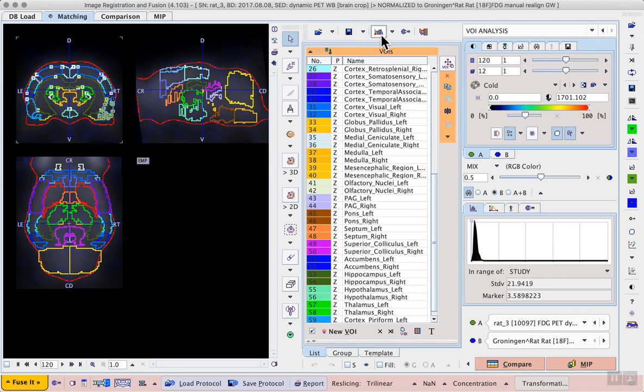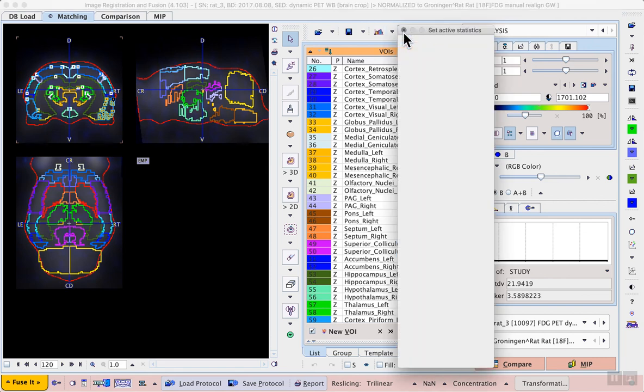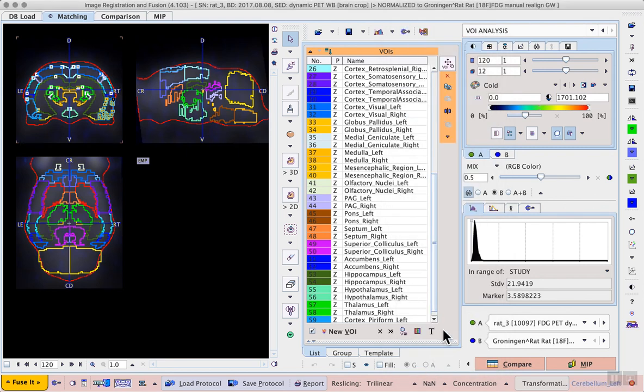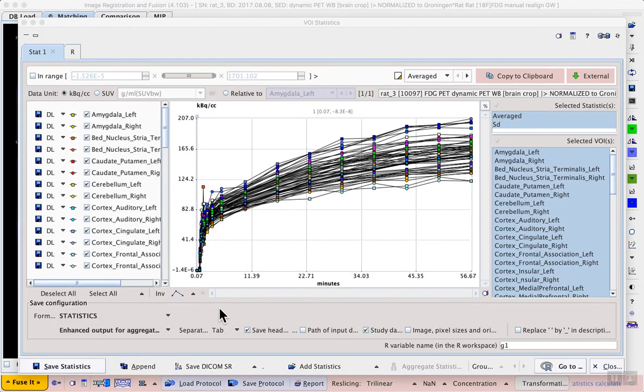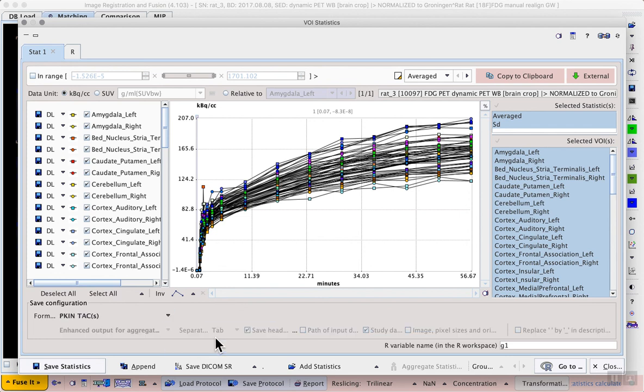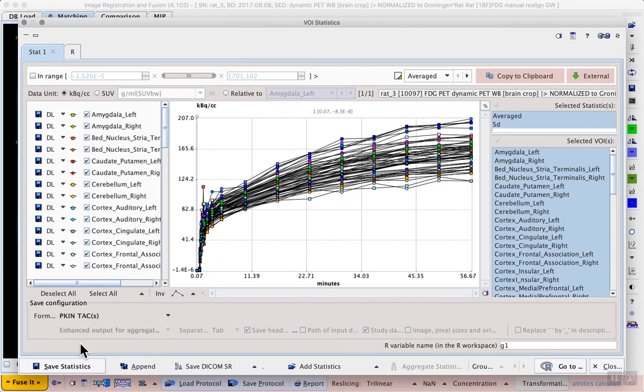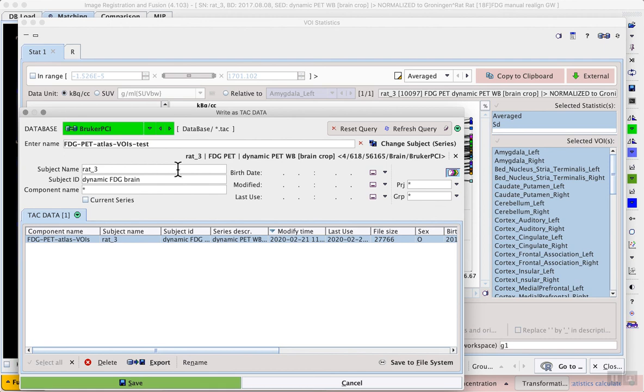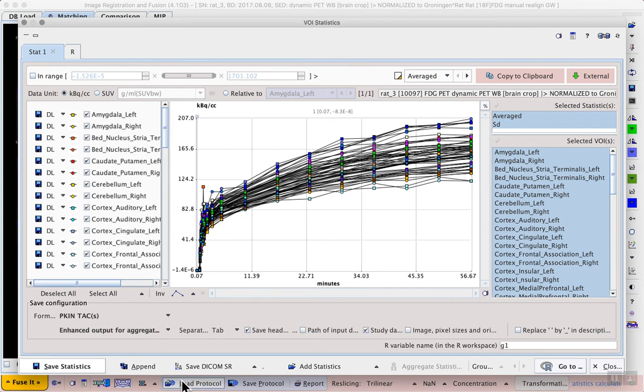We can calculate the statistics using the general statistics button or selected statistics, saving time by only calculating the average and standard deviation. Then in the VOI statistics viewer, we can change the format from statistics to PKIN time activity curves and save the statistics to the database. This PKIN tac file format can be easily loaded from the kinetic menu in the kinetic modeling tool. I'll save these PKIN tacs as a .tac file as my FDG-PET-atlas-VOIs. I distinguish this run-through as my test. And that file will be loaded when we get to Section 4, Exercise 1.